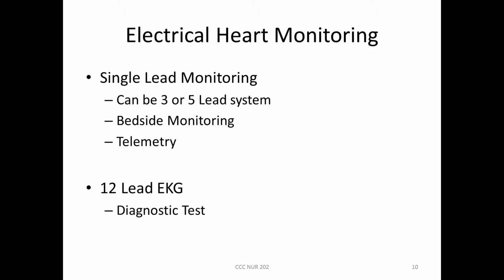They're pretty simple. They can either be 3 or 5 leads. We'll go over the 3 lead in a minute. It's mostly bedside monitoring. You see that in telemetry. These single lead monitors are not meant to be a diagnostic tool. It's meant as a monitoring tool to look at basic rhythms.